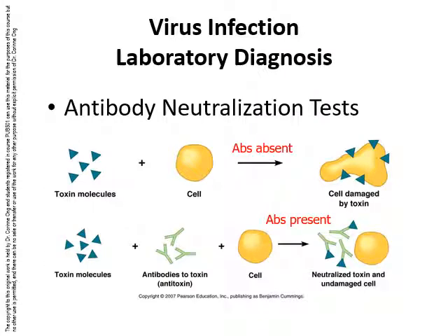If you've never heard of these tests, I'll describe them now, as they're rather complex and confusing, so it may take some explaining. Normally, to look for the actual pathogen or the toxins it produces, we can do a cytotoxicity test by adding the pathogen or its culture supernatant to a cell line cultured in vitro. This is the first test above. If the cells are damaged, we can confirm that the toxin is present and the case is infected.